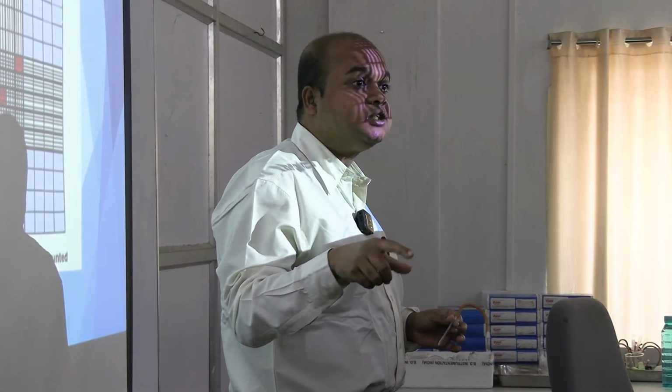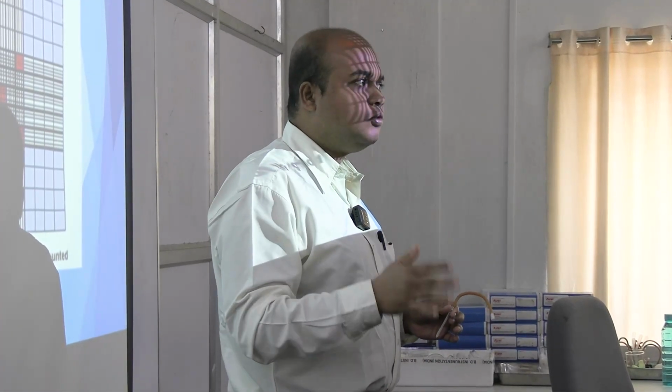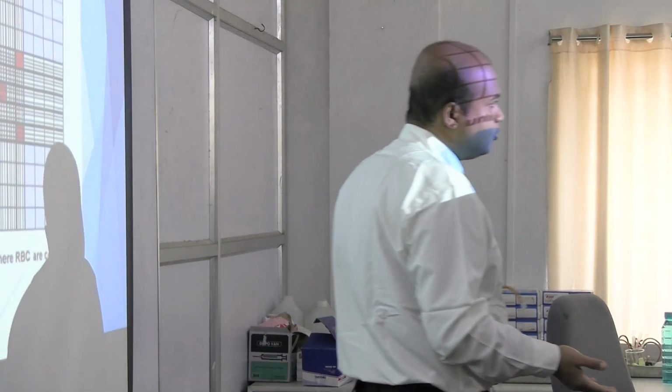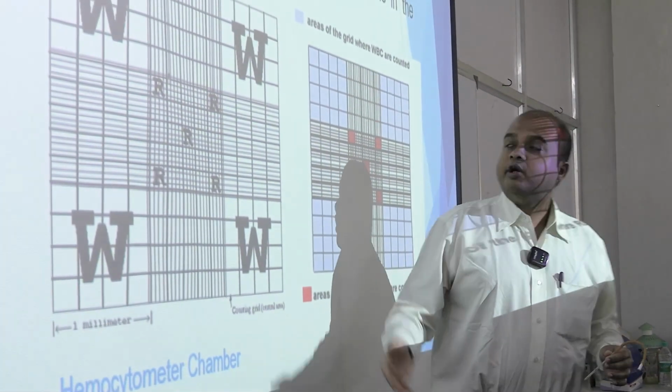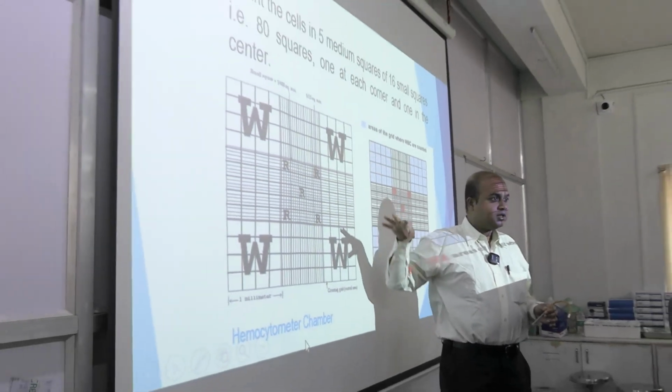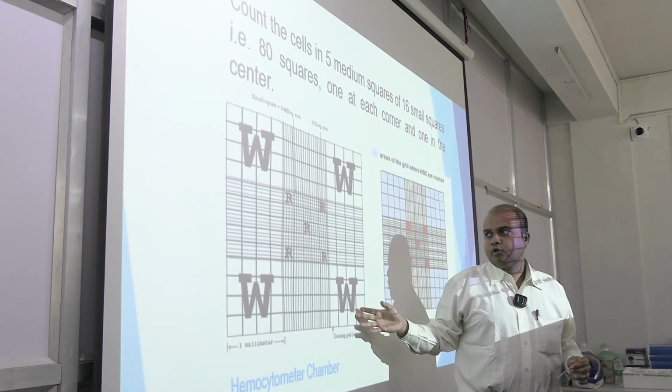That contains 5x by 2 into the dilution factor 20. So it comes to 50x. So put x at the last and multiply it by 50. That is the count of WBCs per millimeter cube of blood, or the same thing, per microliter of blood. 1 millimeter cube is 1 microliter, as we know theoretically. So this is the principle and the procedure of the experiment.